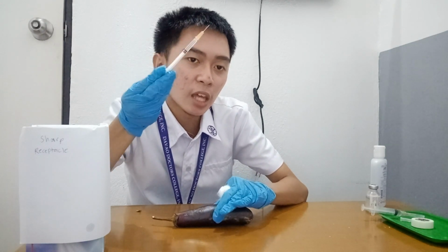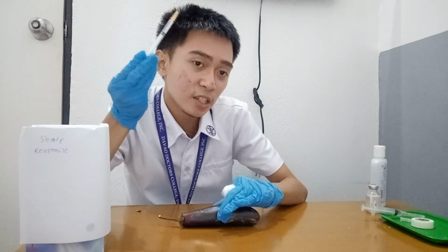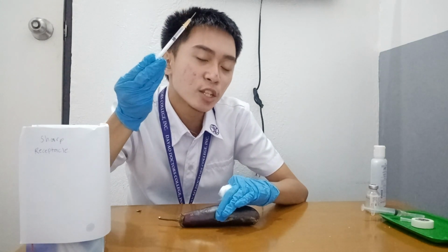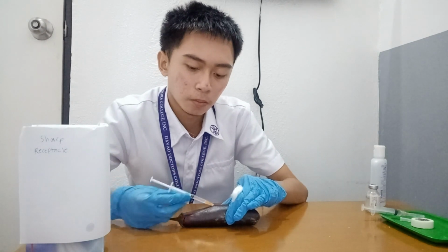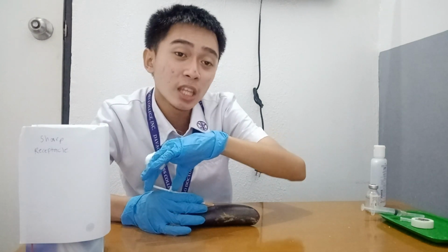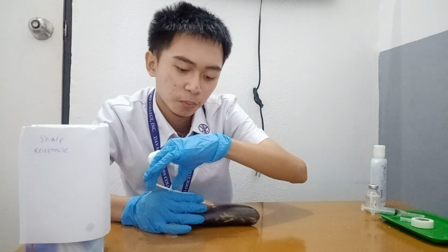When the needle is inserted, move your non-dominant hand to the end of the plunger. Some nurses find it easier to move the dominant hand to the barrel of the syringe and the non-dominant hand to the edge of the plunger. Inject the medication by holding the syringe steady and depressing the plunger with slow, even pressure.